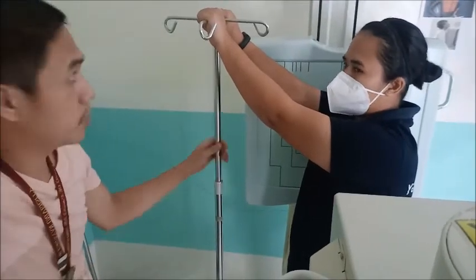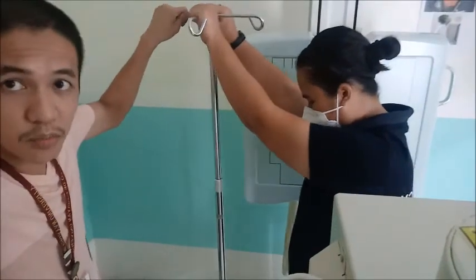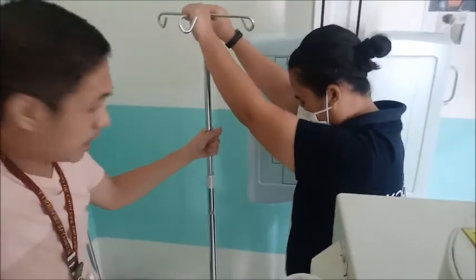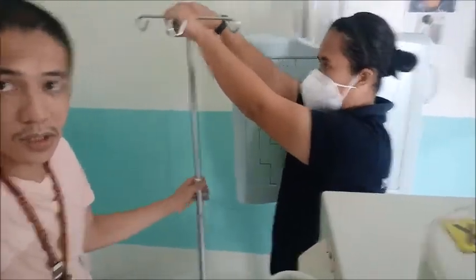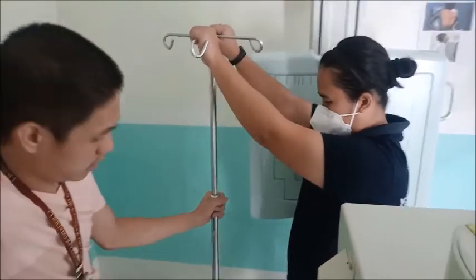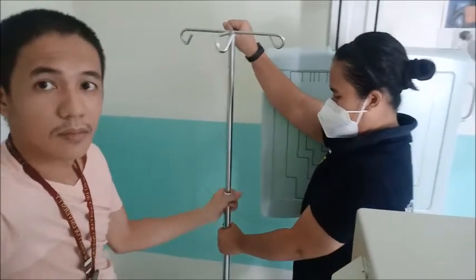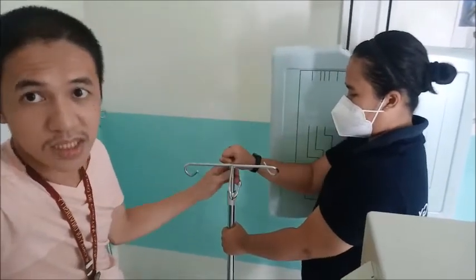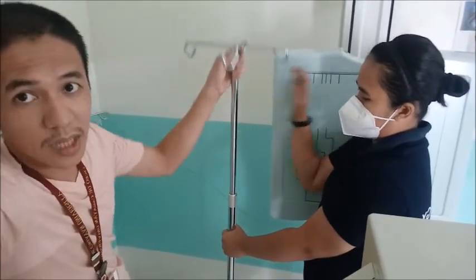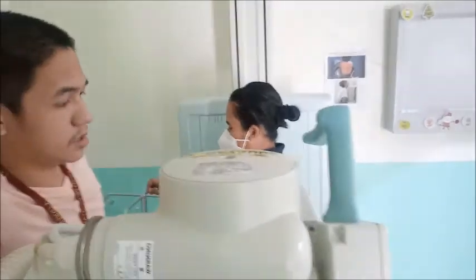This can be released para dali lang pag-move up and down. And if naka-unlock na siya, dali lang i-rotate, mag-slide na siya. So, you have to lock it in place. So, that is for the lateral of the chest.